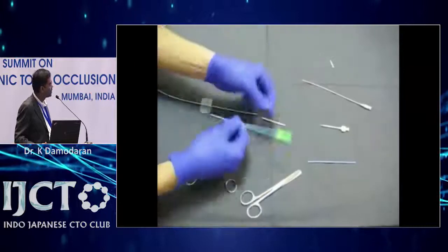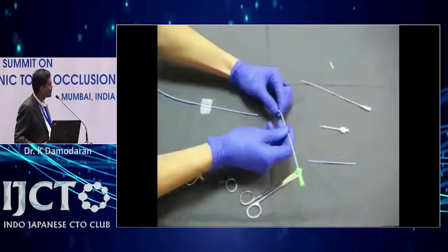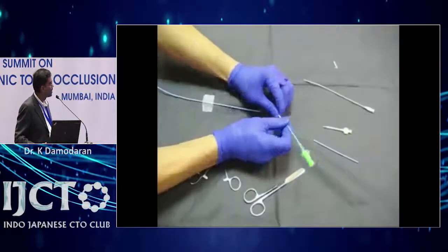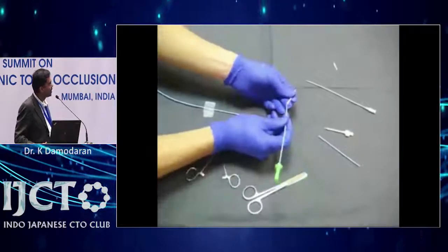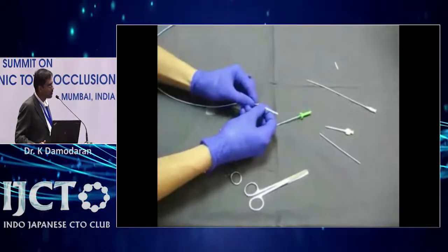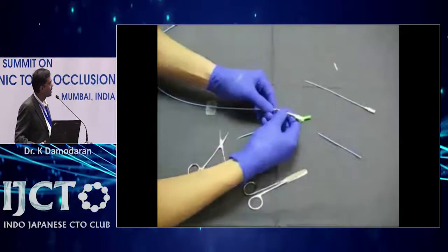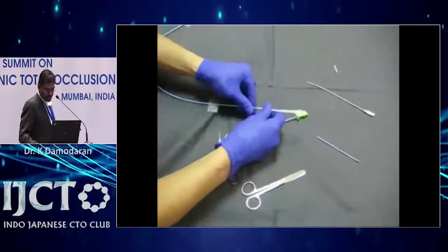The flaring should be very careful because sometimes if you flare with the arterial forceps and other things, it may damage the ends. And once we connect it, there might be air embolism if you inject something, or if the sheath is crushed, then the devices may not be able to pass through the connecting end. So we have to be very careful in this and then reconnect both the ends. Now the shortened guiding catheter is ready.